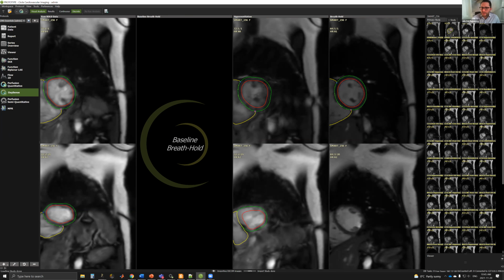However, that same neural network to clean up the hyperventilation data sets will also be applied to the free breathing acquisitions. So then the most reliable portion is indeed the post-hyperventilation breath. For this prototype, we were focusing a lot on the most well-known breathing state and exploring the biomarker landscape from that post-hyperventilation breath hold as a first phase of R&D for it.